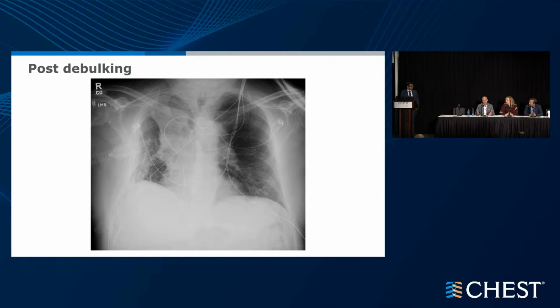For one thing, that was anchoring bias, because that's how I was taught. But now there is increasing evidence that stents after about 45 days, if you look at Lonnie Armas's paper from Johns Hopkins, especially for SEMS, after about 45 days, you have a significant number of complications. 65% of people had a problem that required reintervention, either granulation or migration or plugging, whatever. So they had to do something about it.